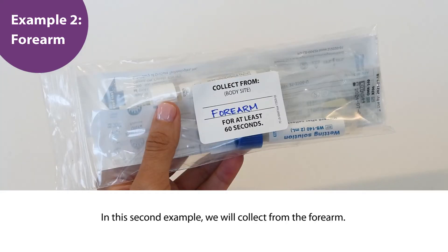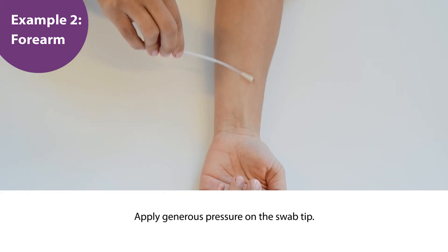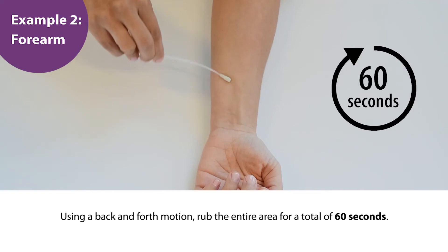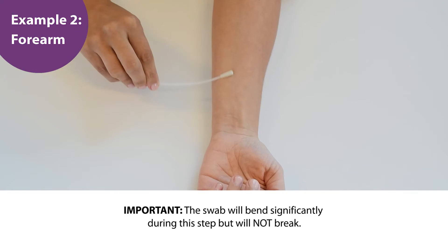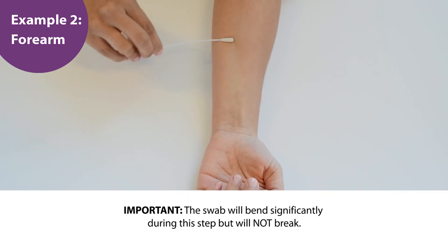In this second example, we will collect from the forearm. To ensure a successful collection, apply generous pressure on the swab tip. Using a back and forth motion, rub the entire area to be sampled for a total of 60 seconds, rotating the swab at least once. Important: the swab will bend significantly during this step but will not break.